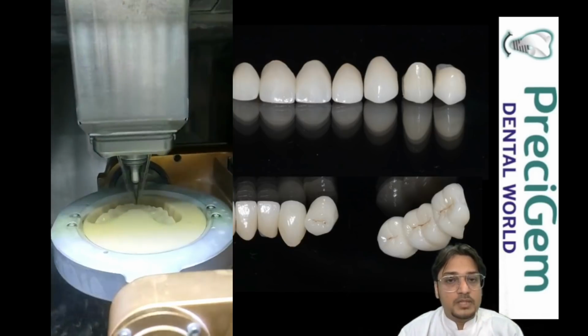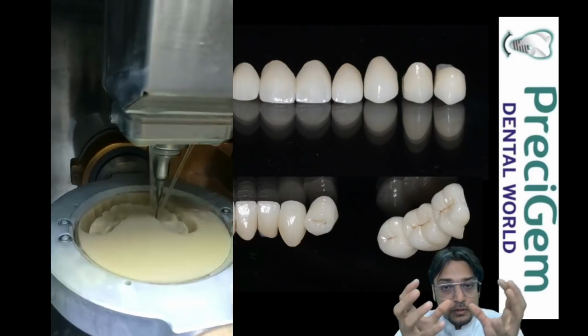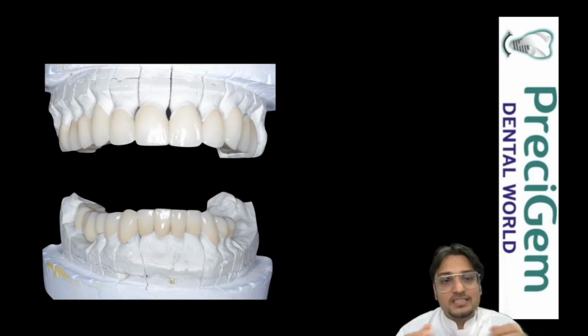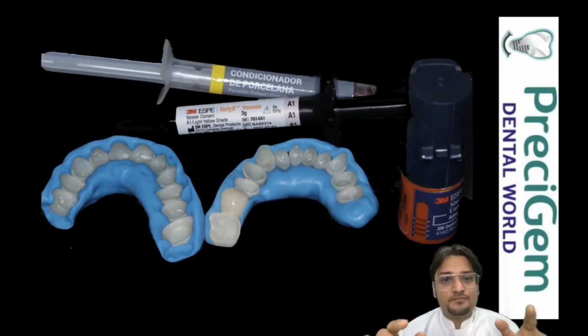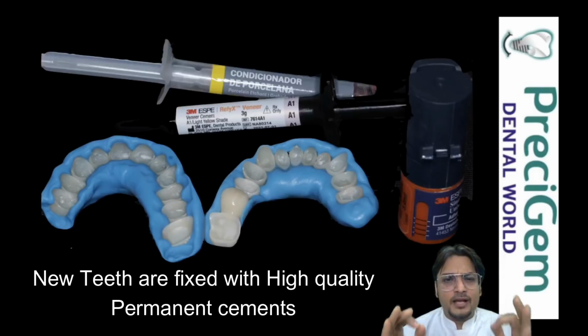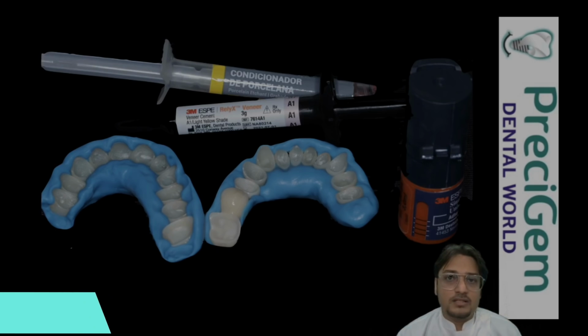In the CAD CAM milling machine, the computer mills your teeth, and the milled teeth come out like this, and these teeth are transferred onto the articulator. It is balanced. After that, we fix your teeth with a very high quality permanent cement. That's the advantage of this cement. It is so strong that it will never ever come out like this.